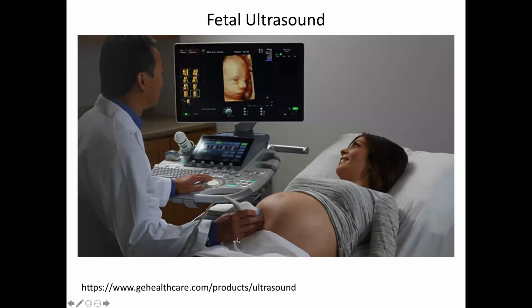Okay. And then 3D imaging. It takes longer, obviously, to make a 3D picture because it's just a stack of 2D pictures. So however fast you can make a 2D picture, you just stack those together and you get your 3D. You can either stack them, or you could just take rotating. So if I have one 2D picture and I draw a line down the center of that picture and then I rotate it about that line radially, that's one way to make a 3D volume. Another way is just to start at the top and move down to the bottom of basically a cube and just make a 3D volume that way.